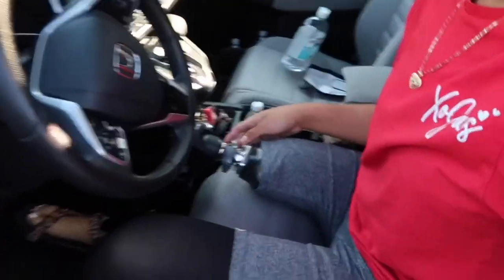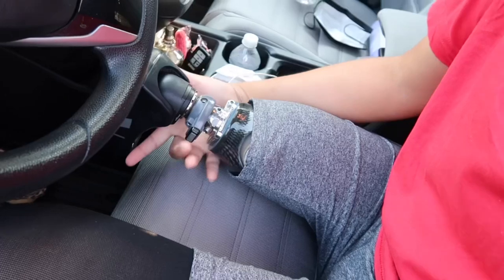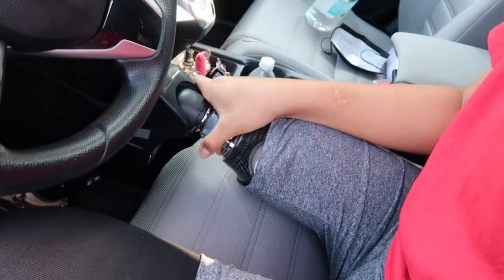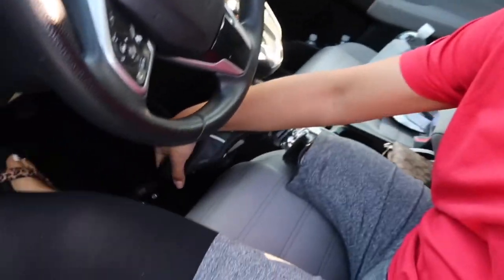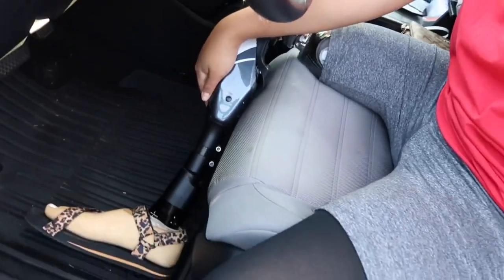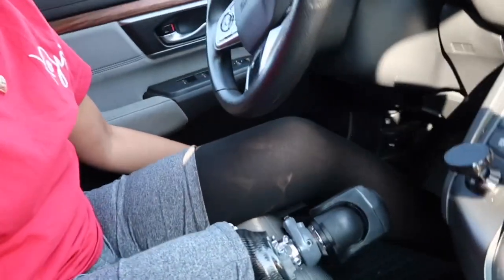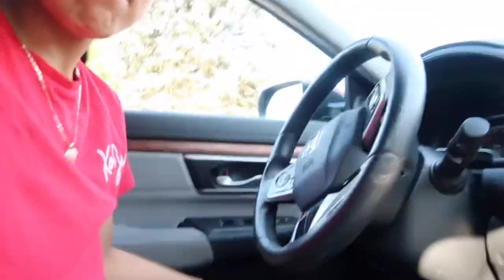All right, so first things first. I click this button, turn it, and I put it like that, by the seat. See how I put it? And then my left leg, I drive normal with it, like you would with your right leg. So that's how I put my leg to drive.